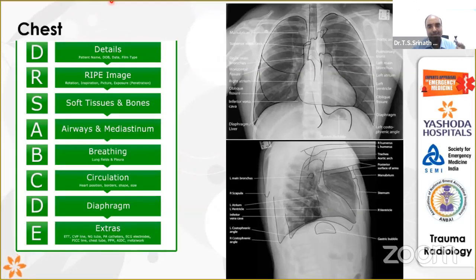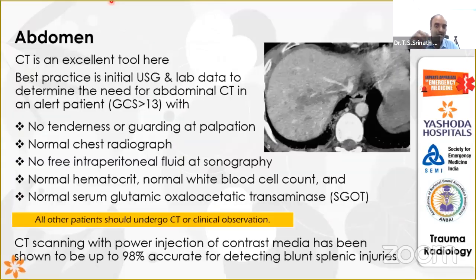Okay, there is no pelvis injury. There is nothing, but still the patient's blood pressure is dropping. What suspicion do you have to keep in your mind? You may not be picking it up with your FAST scan. You may not be picking it up with your pelvis X-ray, but still the CT scan can show something. What is that something? Retroperitoneal bleed. Very good.